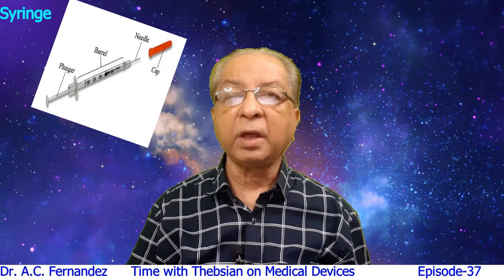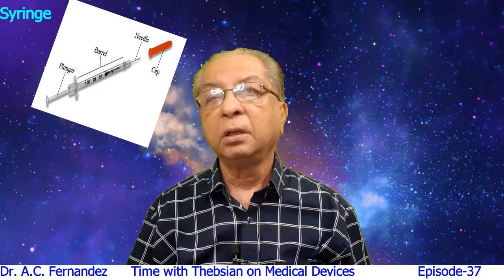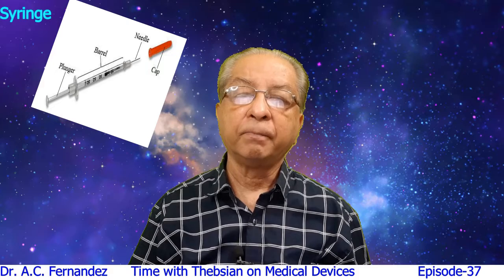Friends, so today we are concluding the video session on syringes. Whatever points I have told you may be familiar to you. Only advice is that whether you use glass syringes or plastic syringes, it should be sterile.